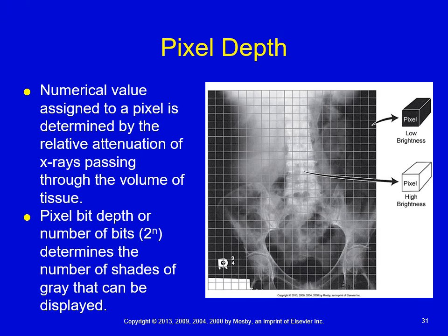One thing that I forgot to mention on that last slide was the downside to having images with a lot of pixels. All right, so the more pixels you have, the more information that image actually has. The more information the images have, the more storage space is required in whatever system you have. So for us, we're talking about our PACS system. So we're talking about larger files based on the fact that those images contain all of that information.